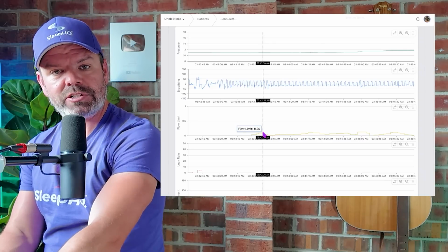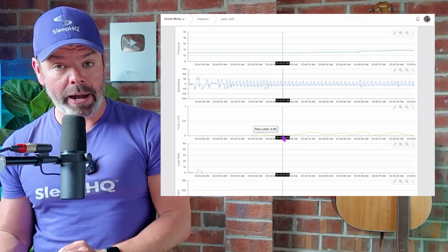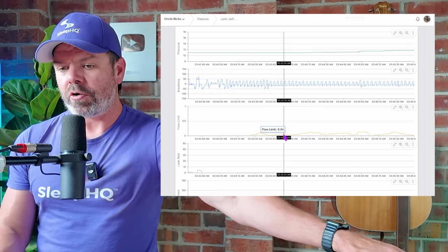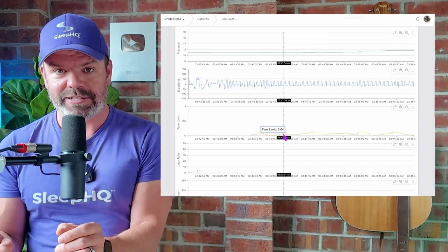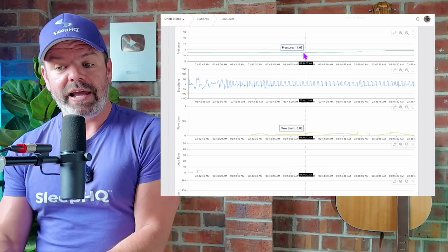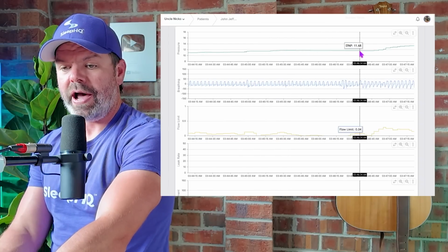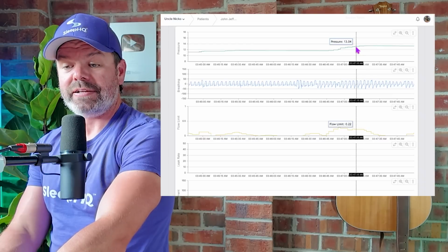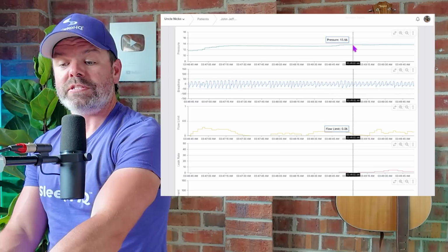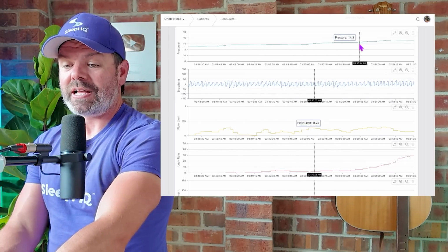the airflow limitation trace. This is upper airway resistance, and the closer this trace gets to 1, the more airflow resistance there is. Now, the ResMed automatic algorithm is highly sensitive to this trace. So it goes, drop the pressure too far, and it starts to recover. And it starts to increase the pressure. See, look at it go. 11.3, 11.48. Oh, now it's up at 13. All right, we're up at 13. Look at it go. Now we're up at 13.6.